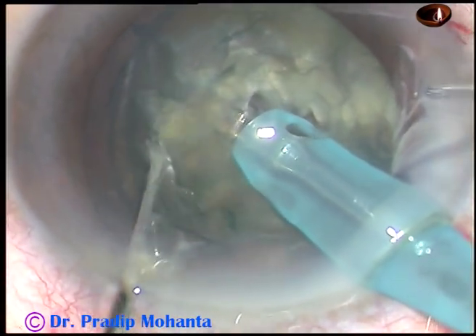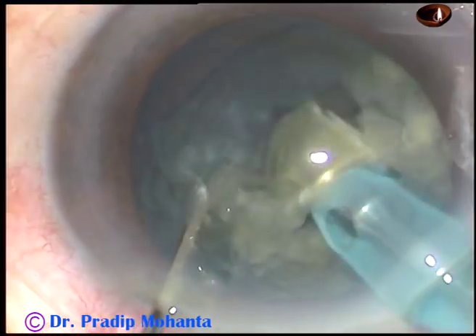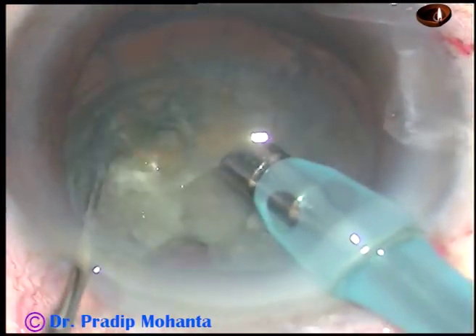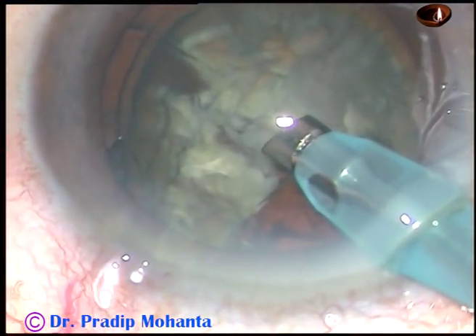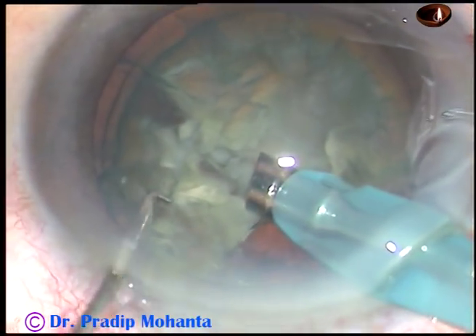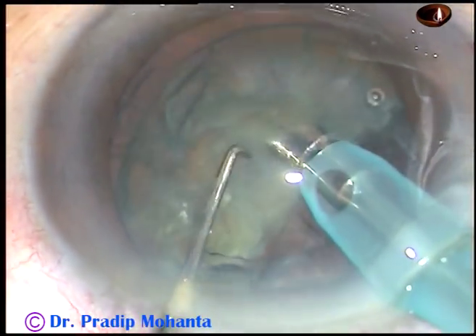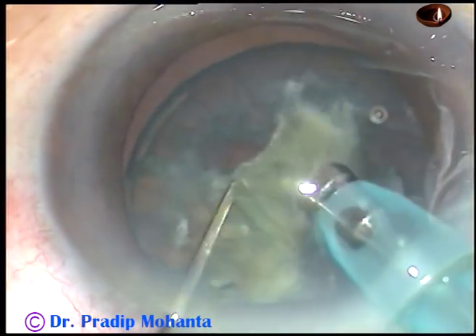So I went directly into the lens mass, chopped the nucleus, divided it again into smaller pieces, and emulsified this piece. I rotate it again, hold the nucleus, and chop it. I turn the tip towards the left side and emulsify the free nuclear fragment. The cataract is of moderate density — it is getting chopped easily and I can comfortably emulsify and remove the pieces.